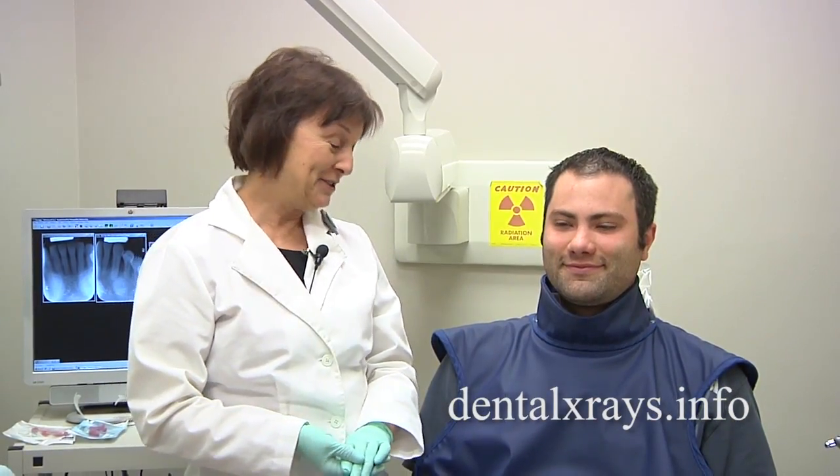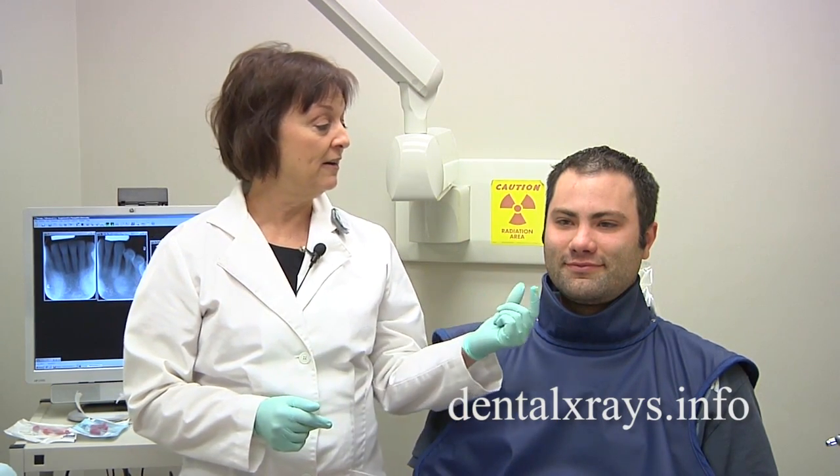I hope this has been beneficial to you in helping you take your x-rays when there are problems such as tori in a patient's mouth. If you have any other questions, please visit us at DentalXrays.info and click on Ask the Experts.